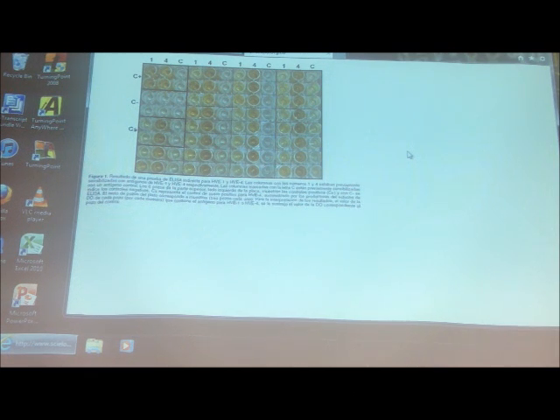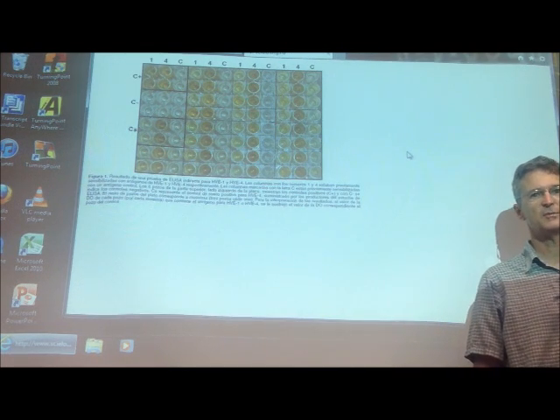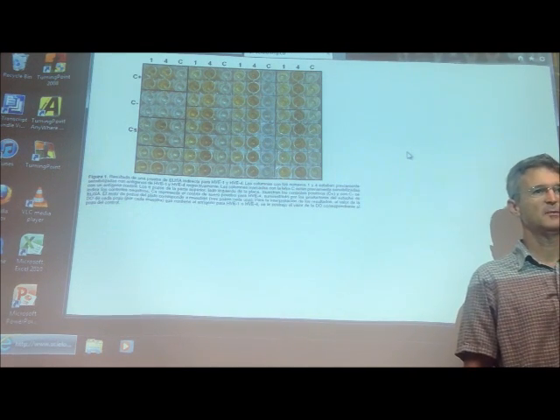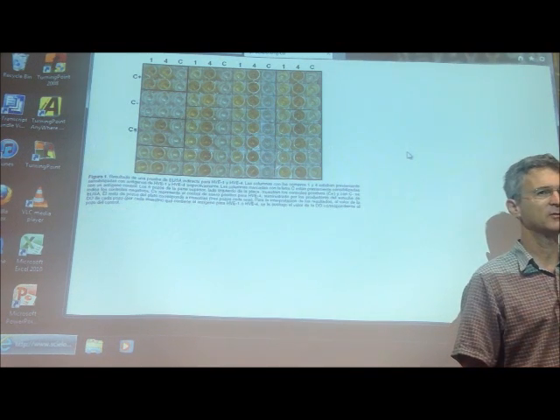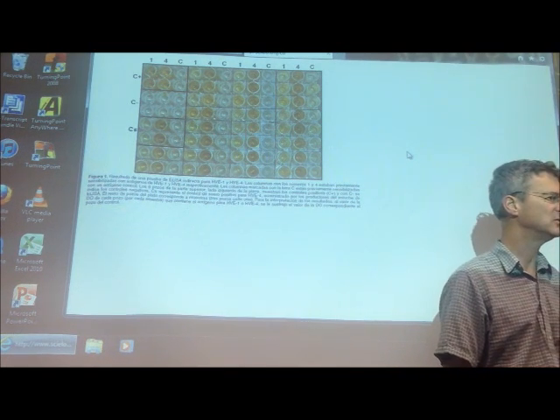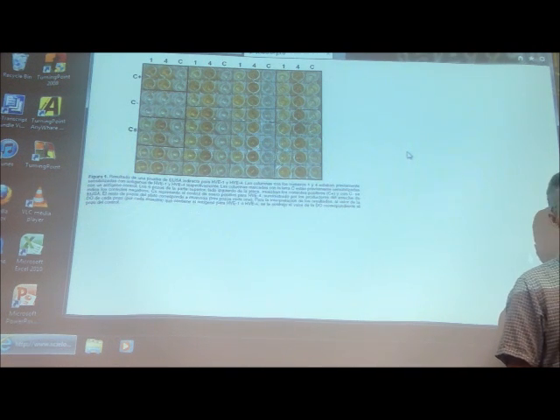Okay, well, we'll start today for lecture 4, and this is on diagnostics and DNA sequence analysis. And so we're just going to start with an old technique, but one that illustrates a lot of background for a huge number of techniques which are used now, and that's ELISA, or enzyme-linked immunosorbent assay.